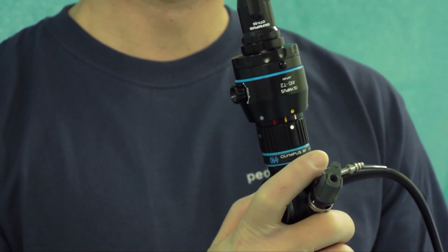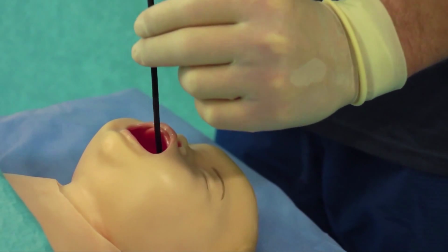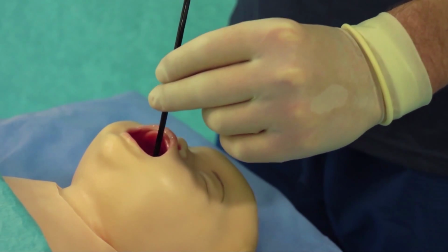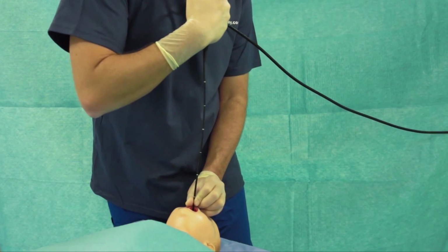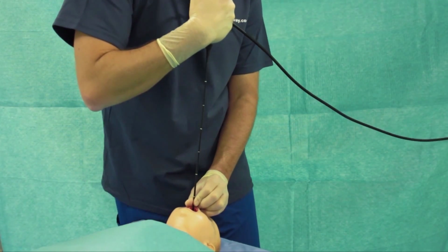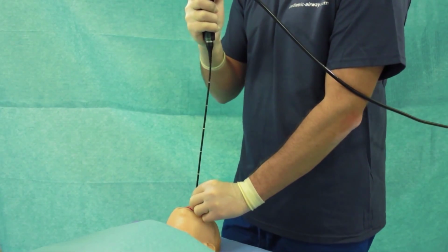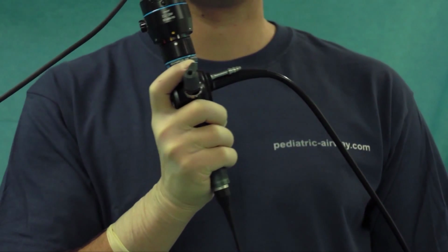Use the handle-holding hand to turn the scope and the other hand to move the scope forward and backward inside the airway. It is important to bring the table into the lowest position and keep the scope straight to make turns with your handle hand easier. Move your body to turn the scope inside the airway.